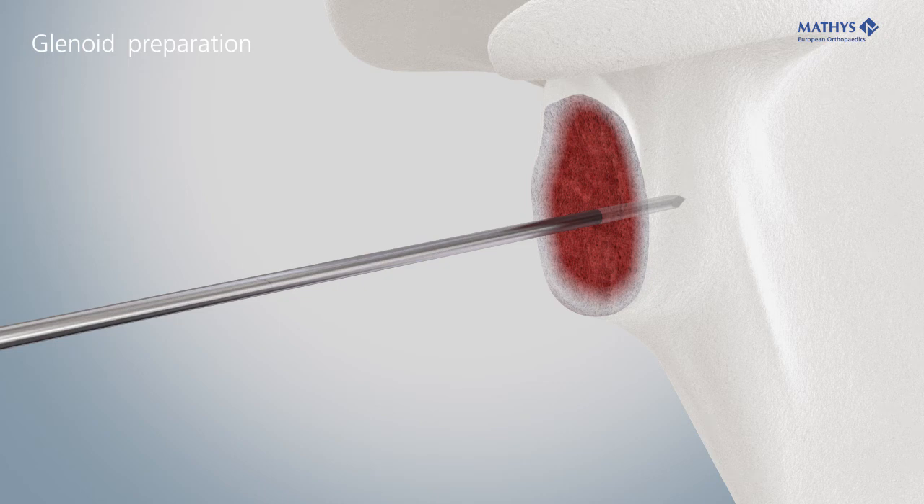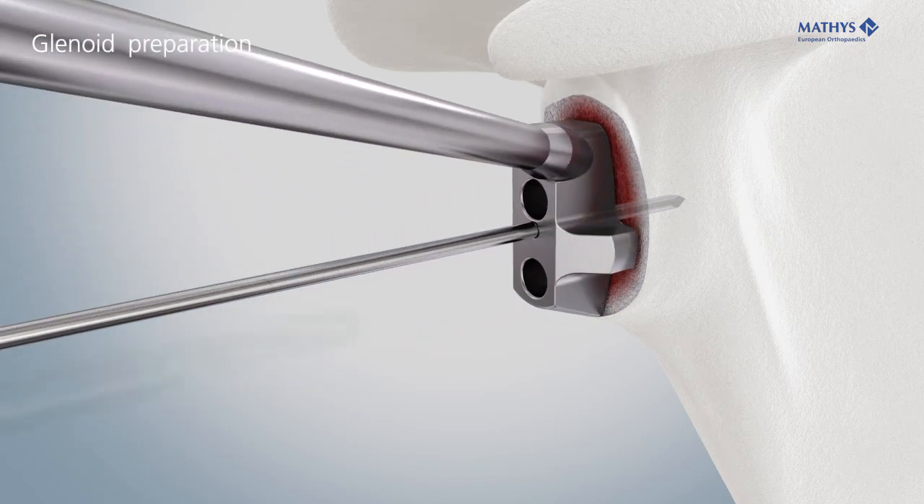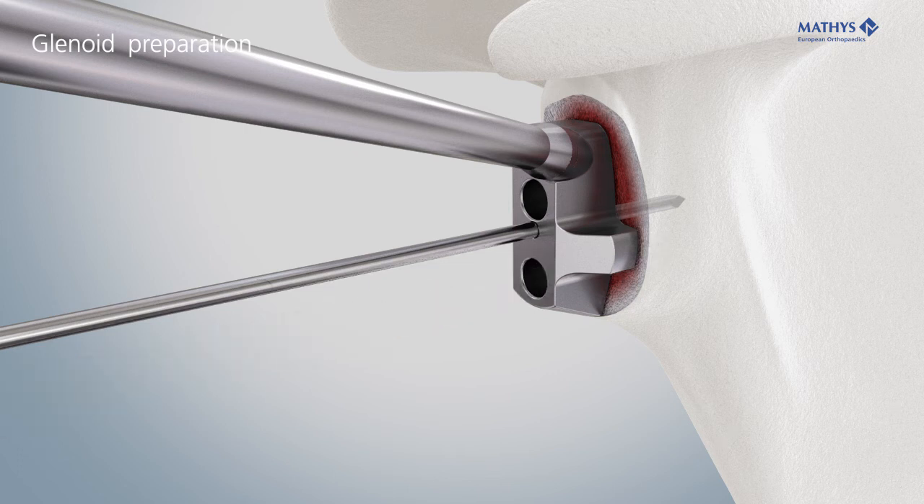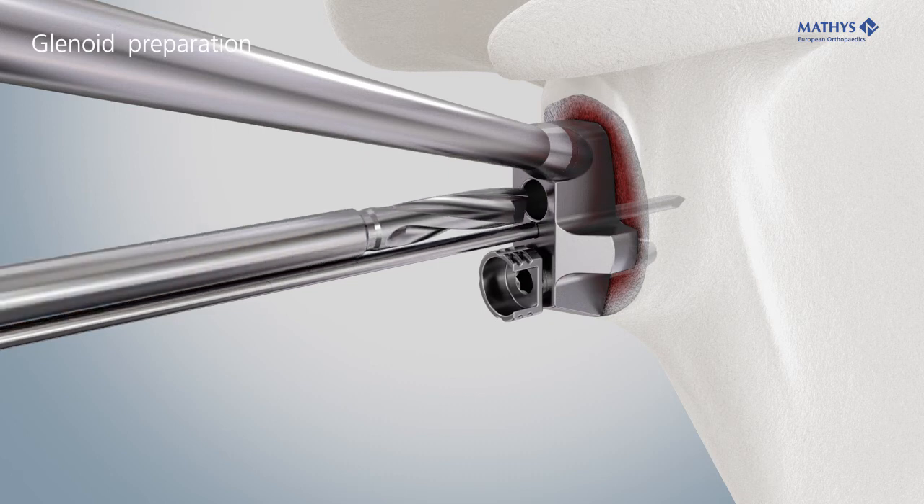To prepare the holes for the pegs, slide the metaglene drill guide over the Kirschner wire. Use the drill metaglene. Insert the fixation pin to prevent rotation of the guide, then drill the second anchoring hole.